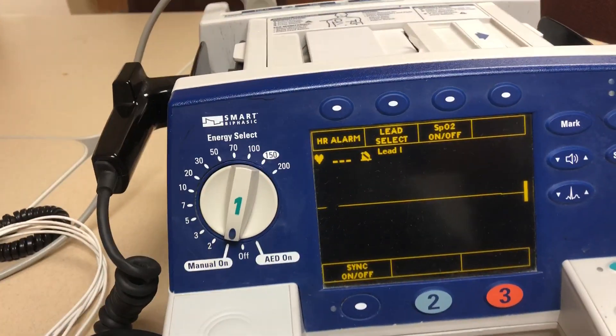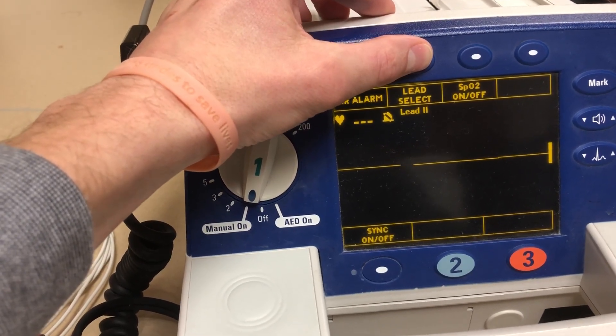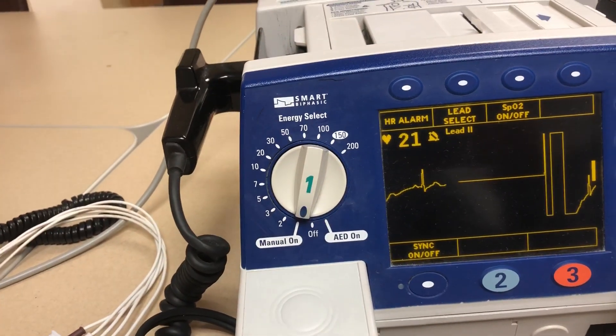Now if you do put the leads on the patient and you don't have the pads on the patient, then you're going to have to pick the leads. So we pick our leads, figure out which one will work, and we're good to go.